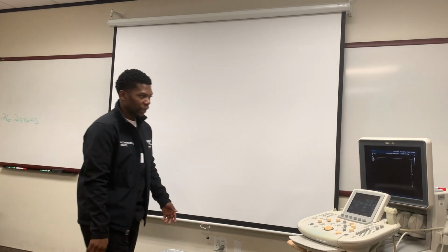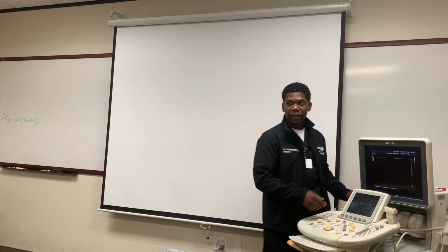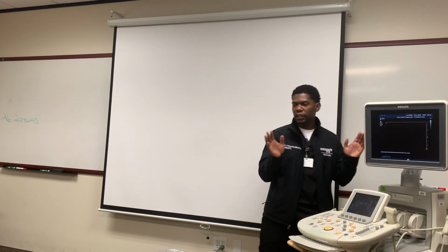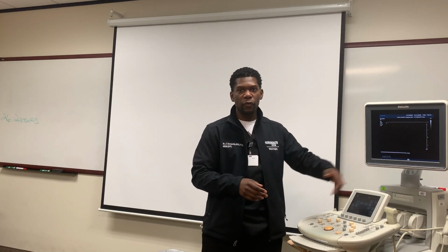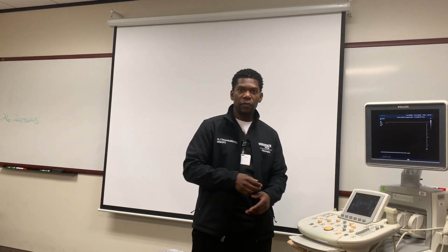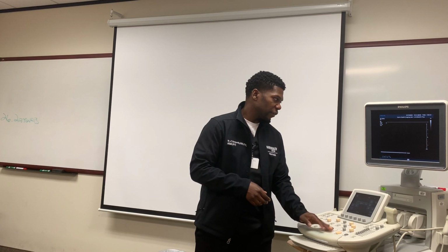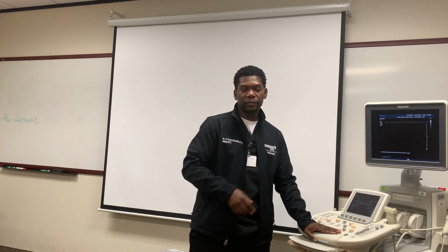Like I think Myra was talking about this the other day. When you press freeze on here, that number right there, F number on here, is telling you that it's at 640, and it's just been resting. So however long it's been holding 640 frames, I can go back. I don't know how much time that was, but let's say, somebody time me for 5 seconds.